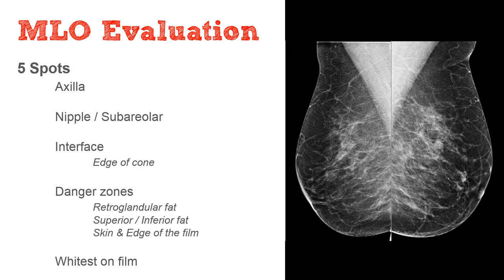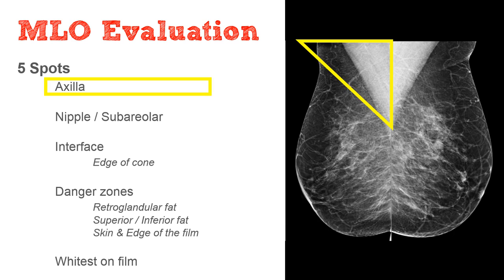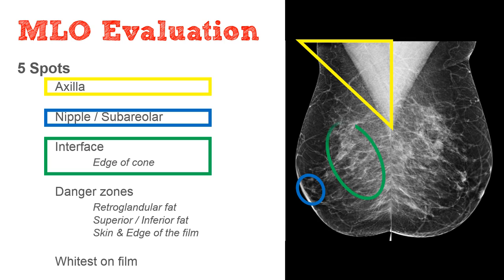First, we want to look specifically at the axilla. Next, we're going to look closer at the nipple subareolar region. Approximately 20% of cancers occur in this region, and they can be very difficult to detect. From here, we're going to look at the edge of the glandular cone. At this interface is where the majority of breast cancers occur. So you want to ensure that your eyes make a rim around the outside of this glandular tissue.